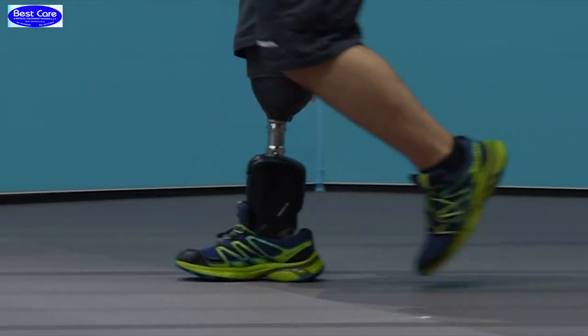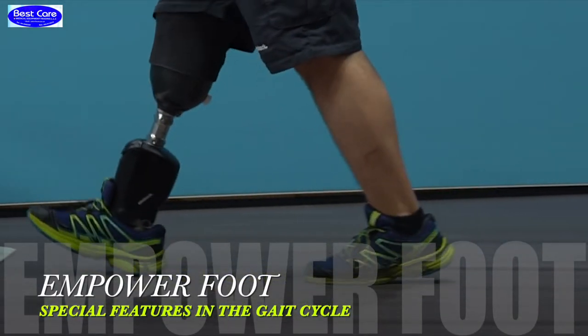Increase the resistance if you observe foot slap or if there is no knee flexion observed during the loading of the limb.